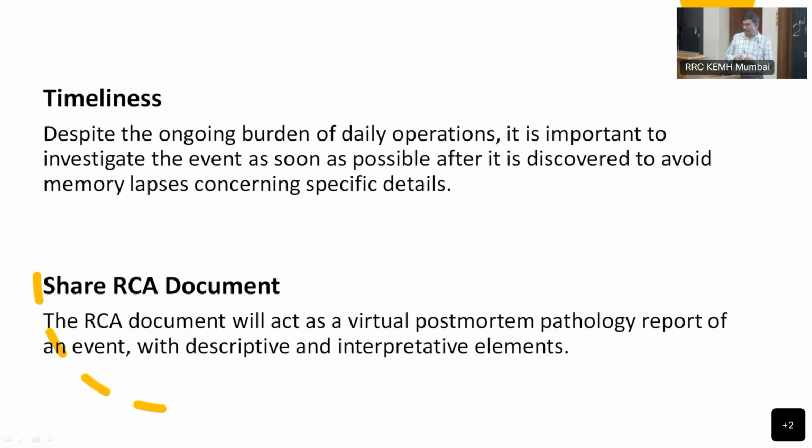Timeliness is also important, correct? Despite the ongoing burden of daily operations, it is important to investigate the event as soon as possible. Because of recall bias, it should be investigated immediately. And the RCA document should be prepared immediately. So, RCA is just a postmortem, I'm telling you. It's like a postmortem of what the problem is.